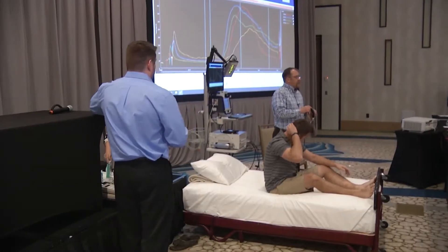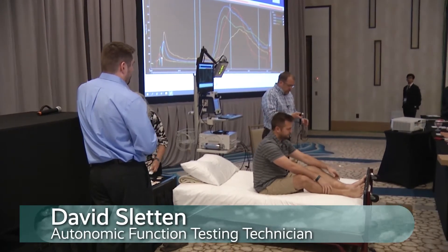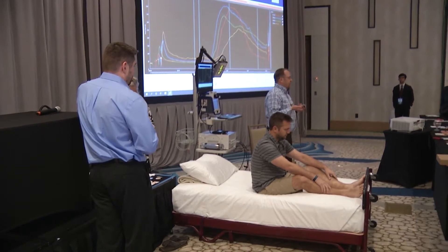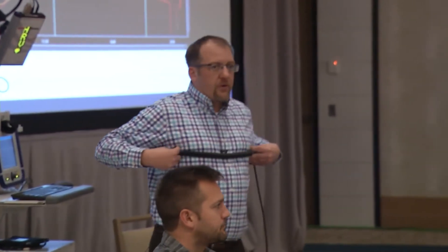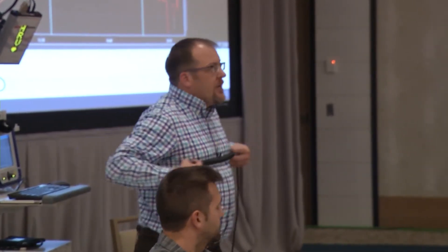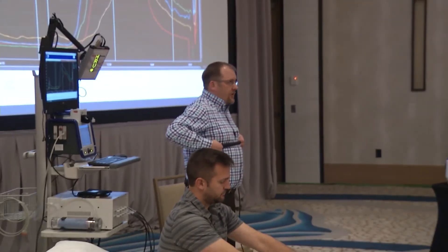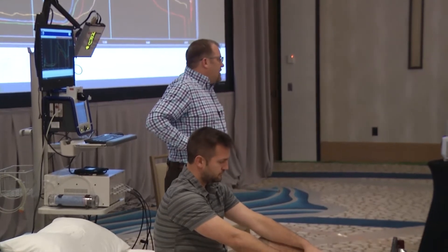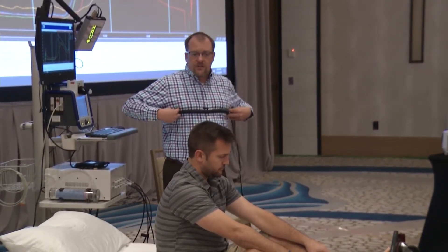The first thing we're going to do is set up for the cardiovagal and adrenergic components. We're going to put a chest bellows on. It's important that we're looking at those lung receptors, so we really want to make sure that we're going over the chest. With males we say to go over the breasts; with females we go just underneath the breast line. We don't want to see them over the stomach — we're really trying to look at those stretch receptors in the lungs.